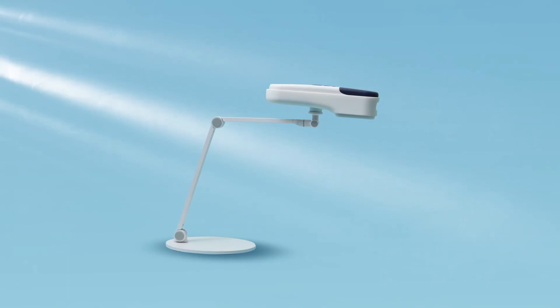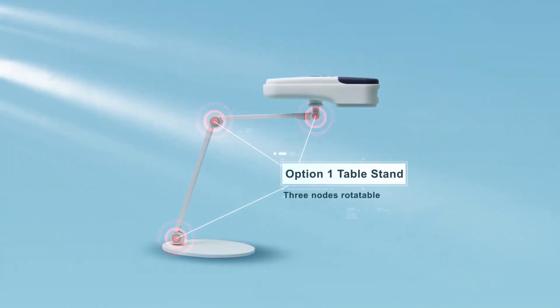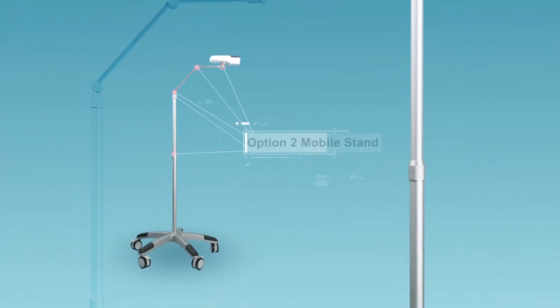Option 1 is a stable stand that supports angle rotation and height adjustment. Option 2 is a mobile stand that is angle rotatable and height adjustable by a wide margin.